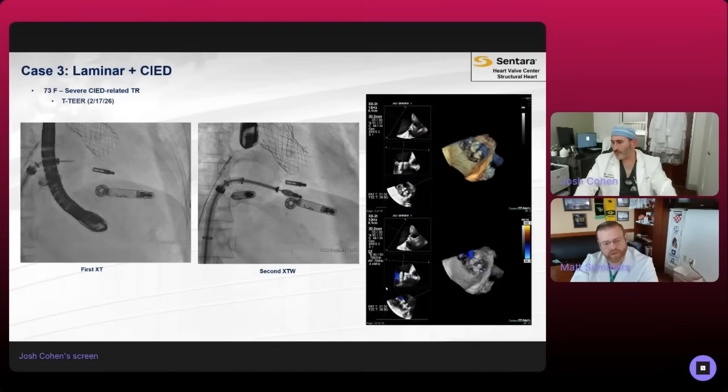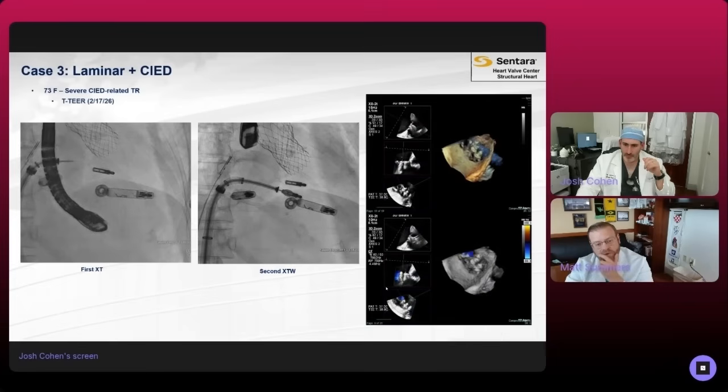It also, the clip wants to transmit that torque later. And so you tend to get a lot of spins and you don't want to make a ton of movements under the valve, of course. And so lining things up in this way is really key from an operator standpoint too, and making sure you understand the 3D anatomy in the context of a two-dimensional fluoro image.